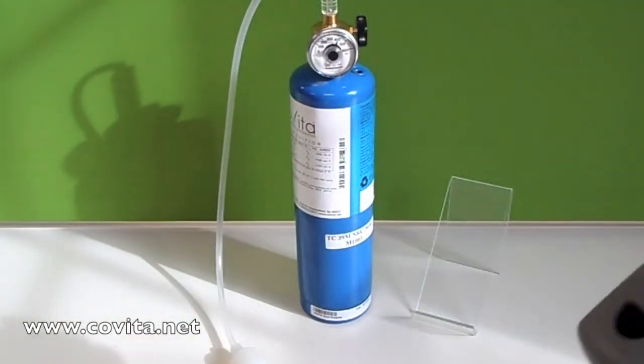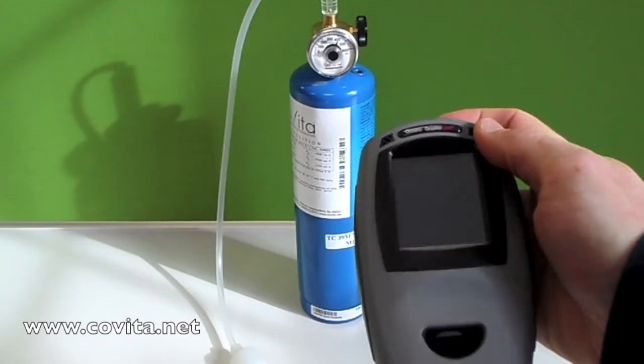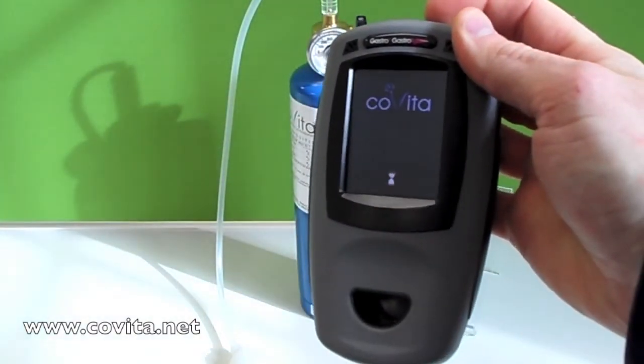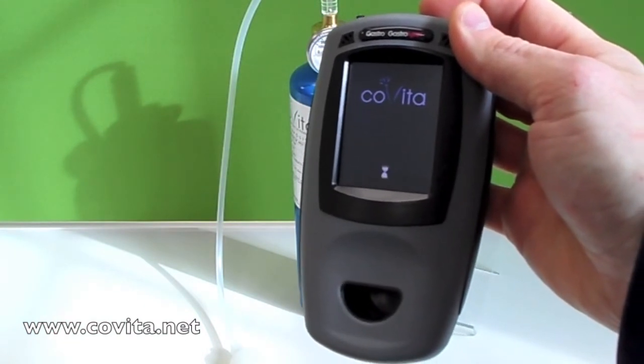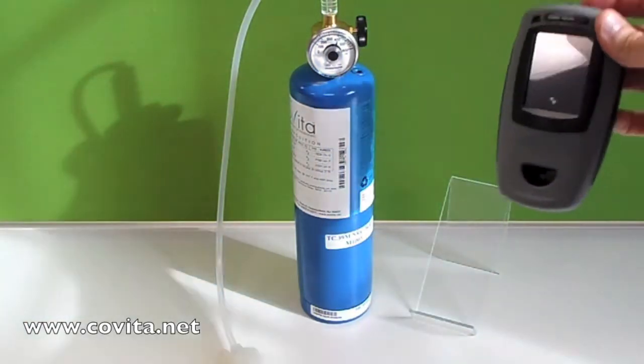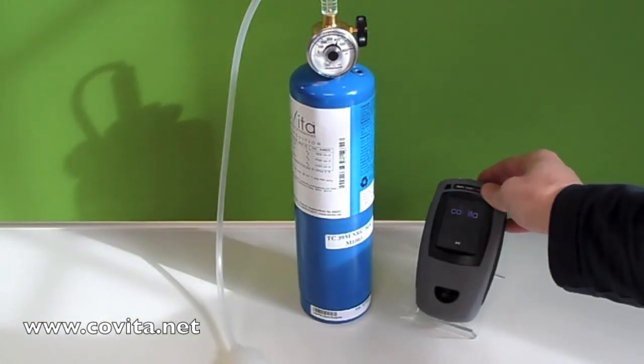Now, let's turn on the Gastro Plus Gastrolyzer. This can be done by pressing the on-off button on top of the Gastro Plus, holding for three seconds, and then releasing. At this time, the device is auto-zeroing for the environment that you are in.